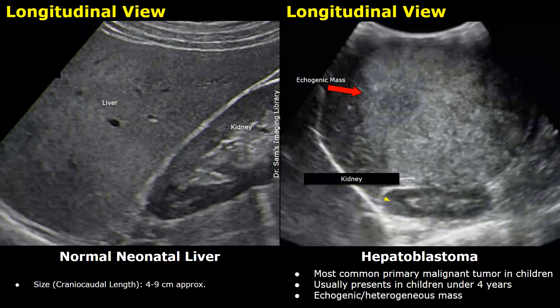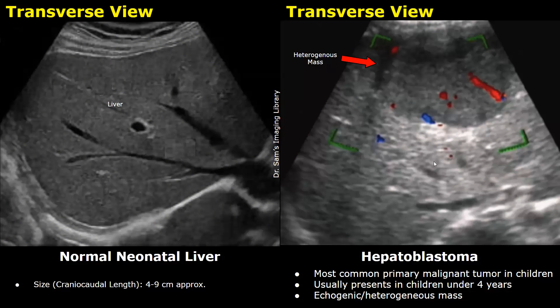This is another case of hepatoblastoma — a large echogenic mass is seen in the liver. In this case, the mass is heterogeneous and somewhat hypoechoic compared to previous images, and some internal vascularity on color Doppler is noted.